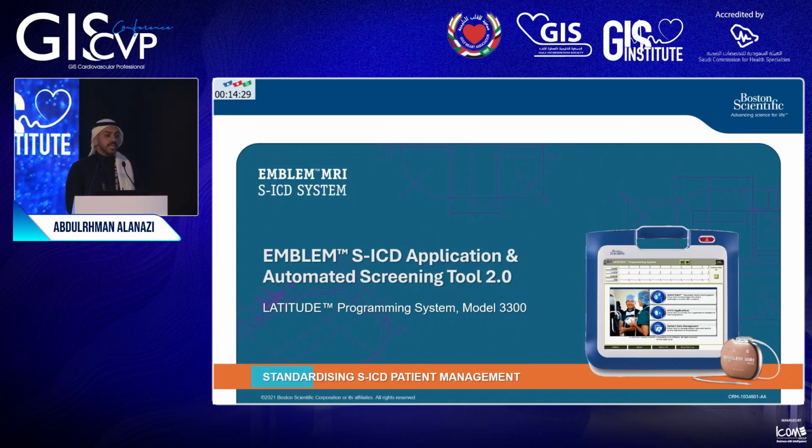A subcutaneous ICD is just an extravascular ICD that is not inside the heart like the regular ICD, and it provides a shock ability to prevent sudden cardiac death.